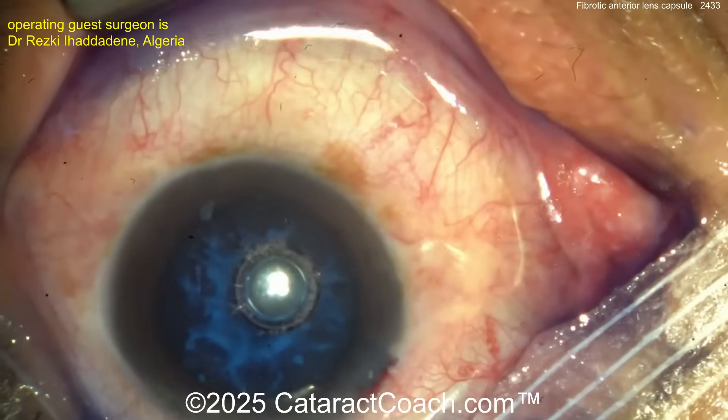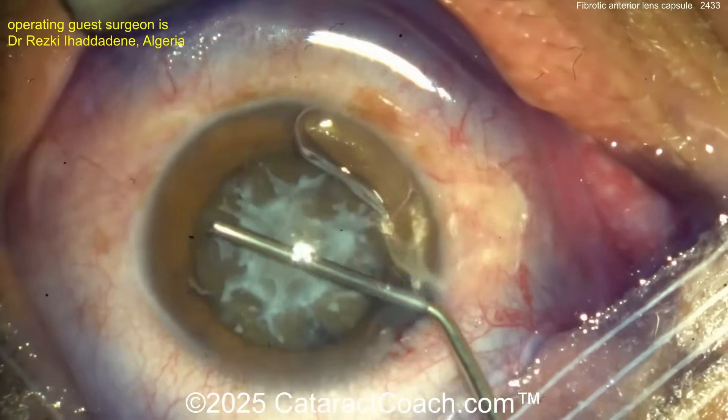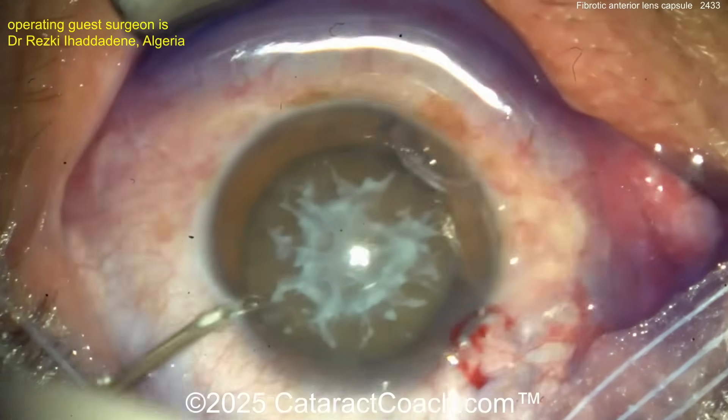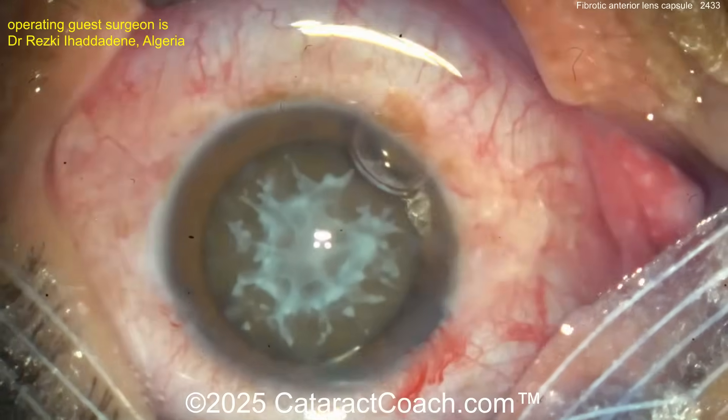Wash that out and let's see the stain we get. We've sped up the video because cataract coach fans like to get right to it. Now here comes the viscoelastic. The key is that rhexis can be really hard with these fibrotic changes — they can be very difficult.